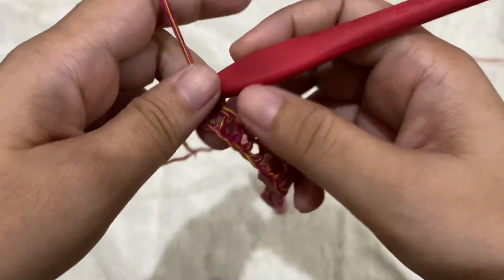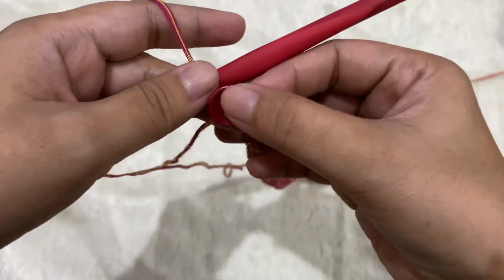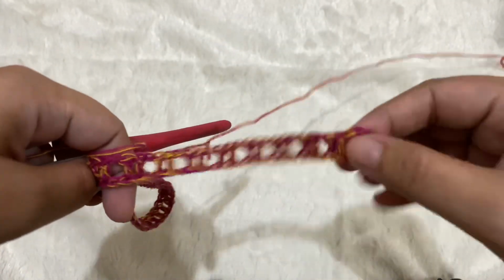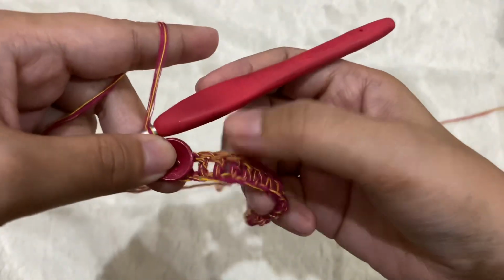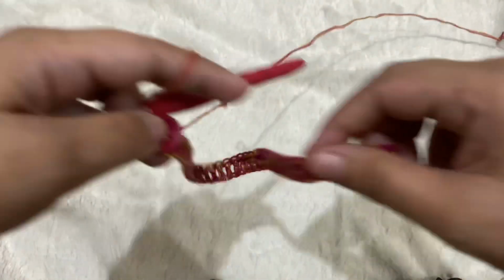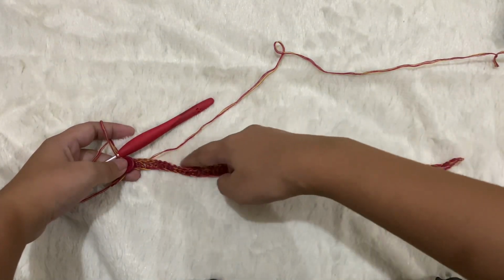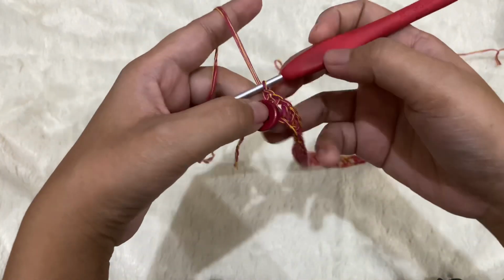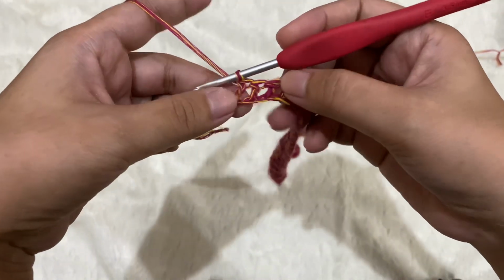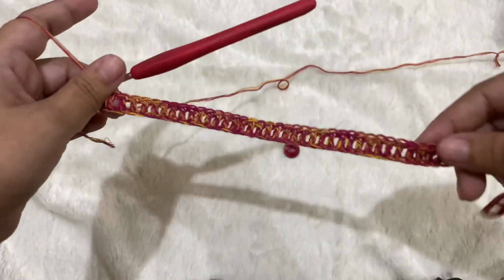So we are at the end of round 2. If you used a thicker yarn and your ear saver feels sturdy enough, okay, you can end your work right here. You can cut your yarn, okay, just leave a tail and sew the button on the ear saver. Okay, but for me it feels a bit flimsy, so I will add a row of single crochet. Okay, so I will add another row around both sides, all single crochet to make it sturdier. Okay, but again, if you have used a thicker yarn and it's already wide enough and sturdy enough, you can skip this row of single crochets.